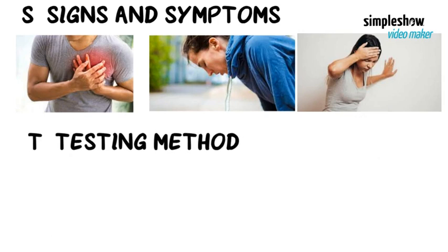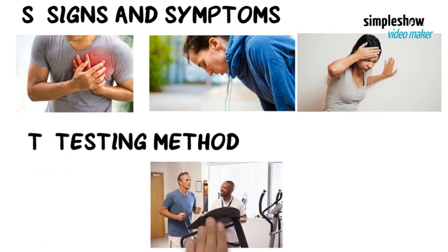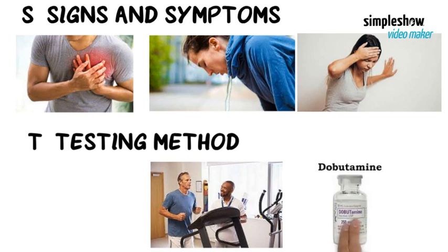T. Testing method. The stress test is usually performed using an exercise treadmill or a pharmacological stress agent like dobutamine or adenosine. The choice of method depends on the patient's ability to exercise and their specific medical condition.